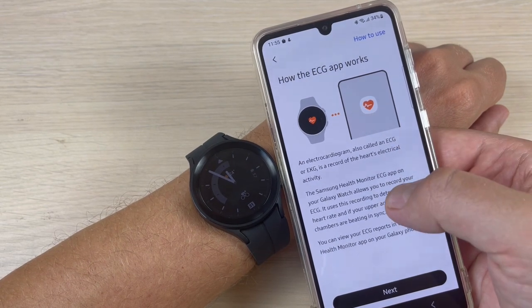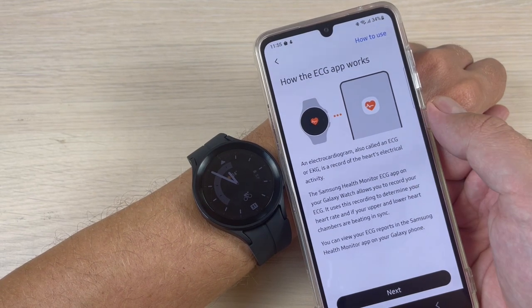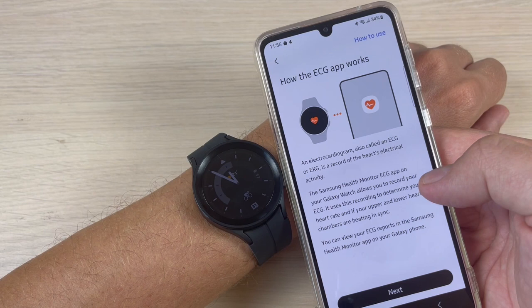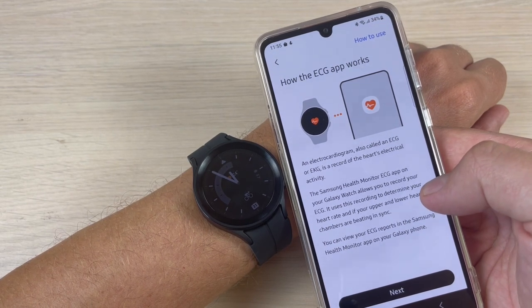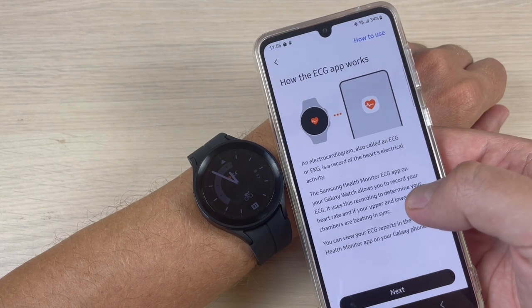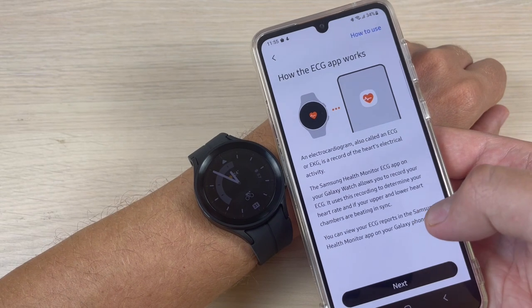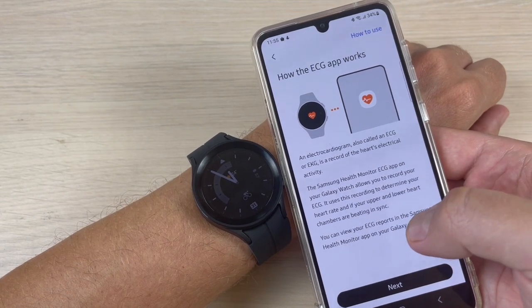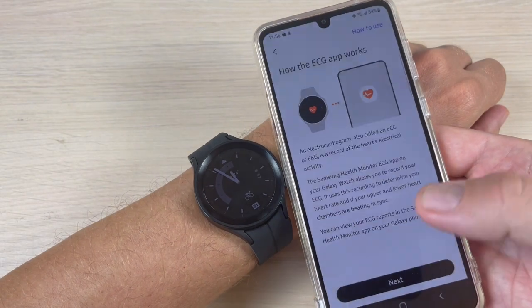Your Galaxy Watch allows you to record your ECG. It uses this recording to determine if your heart rate and your upper and lower heart chambers are beating in sync. You can view your ECG report in Samsung Health Monitor on your Galaxy phone.